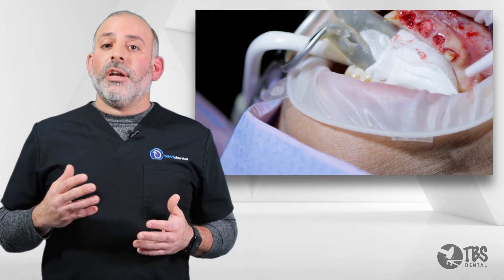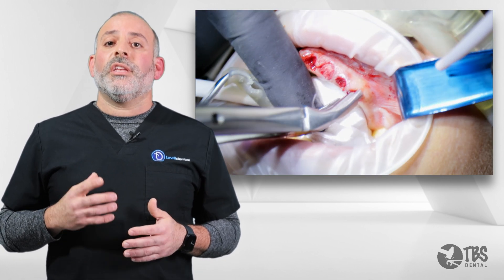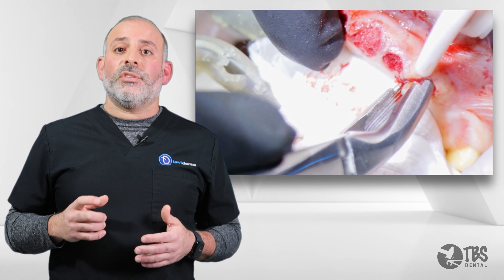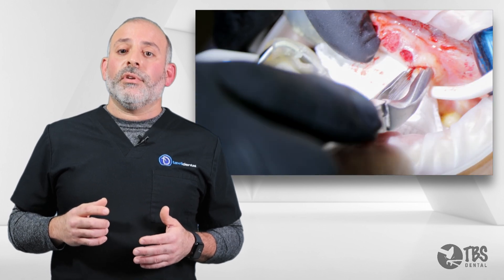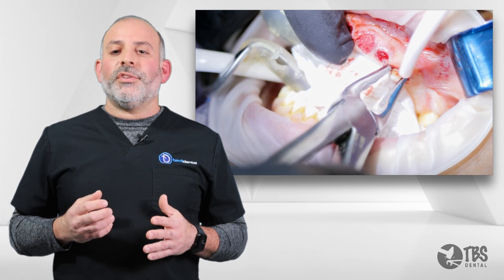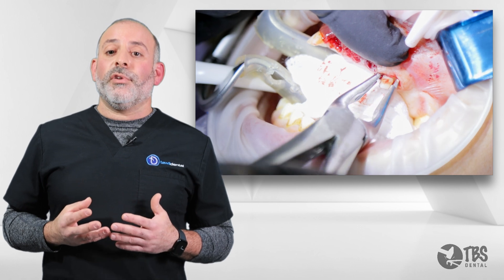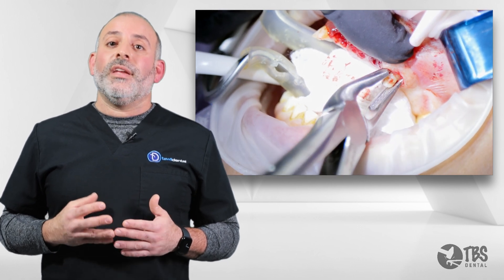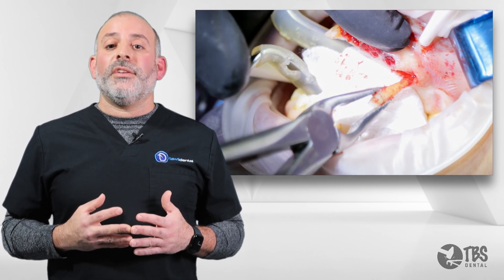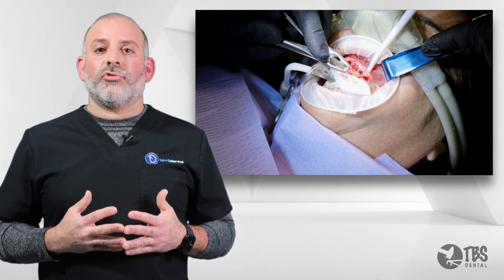Once we begin to mobilize the root with the alvatome, we can then pick up our frings forcep — keeping our finger on the hinge itself so we can get deeper and deeper — and then provide rotational movement. This was a crown tooth. Even a crown tooth cannot escape the serrations of the frings. These are the BTG frings, which get deeper and deeper into that periodontal ligamental space and provide easy access for us to ergonomically extract the tooth.